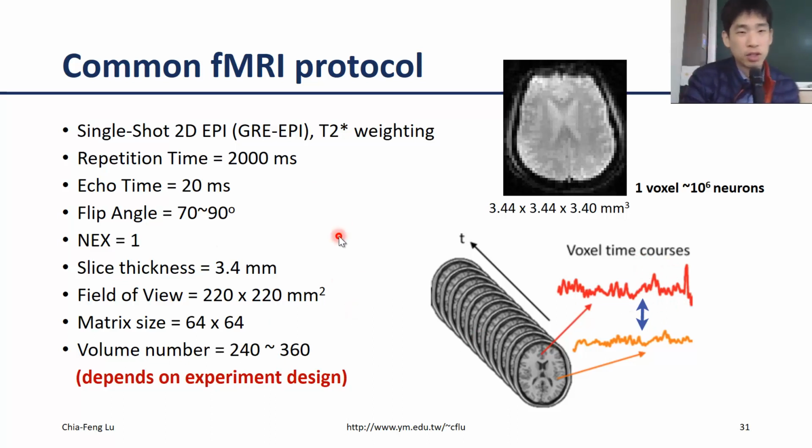Okay. So this is the general idea that I try to give you, that the protocol is more like this. But people may ask, then typically how long do I need to ask my participant to stay in the MRI?